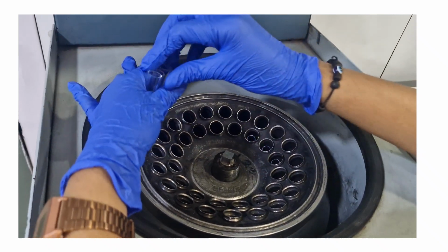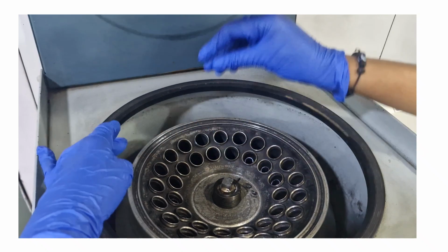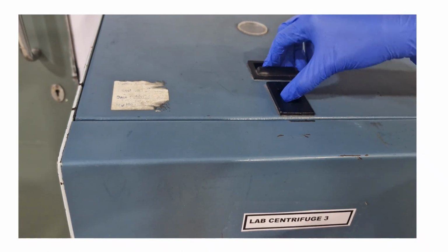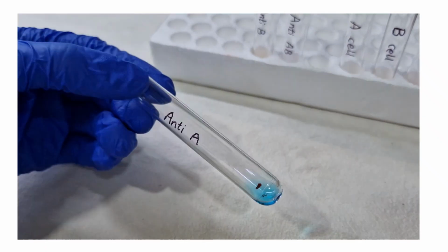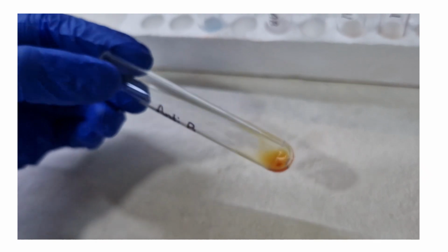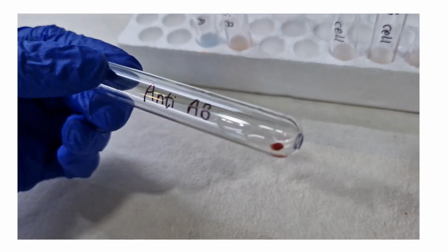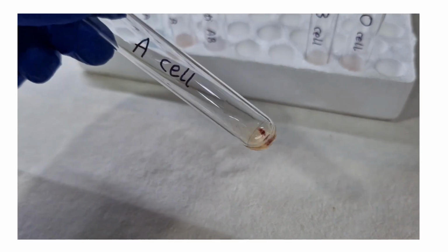Transfer the tubes of forward and reverse grouping to the centrifuge. Make sure to balance the tubes against each other. Centrifugation has to be done according to the manufacturer's guidelines. Coming to results of forward grouping, in anti-A, there is a strong 4+ agglutination. In anti-B, there is no agglutination. In anti-AB, there is a strong 4+ reaction.